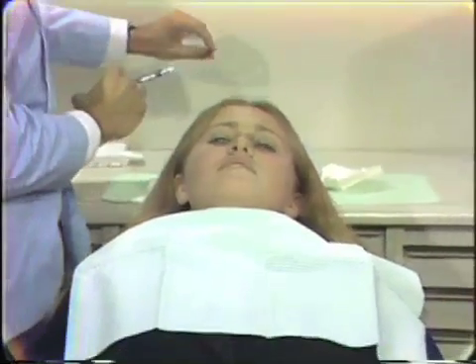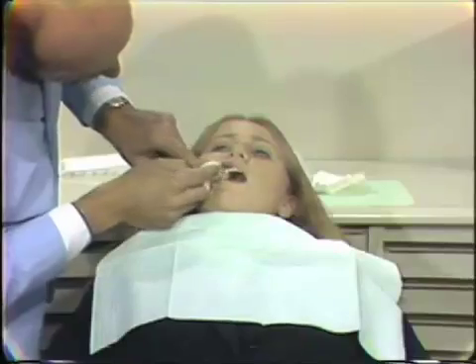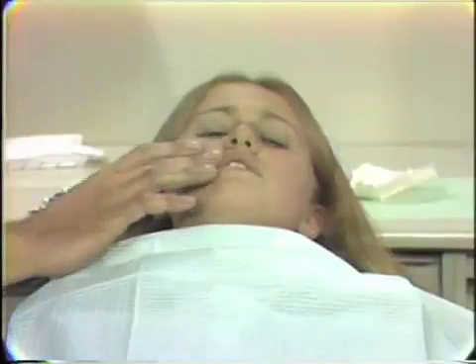Place your tip back on your syringe. I generally like to go back to my injection site and be sure we're not getting any hemorrhage, which we aren't. If you are, hold your cotton gauze over it. Otherwise, you're all set to let that get good and numb.